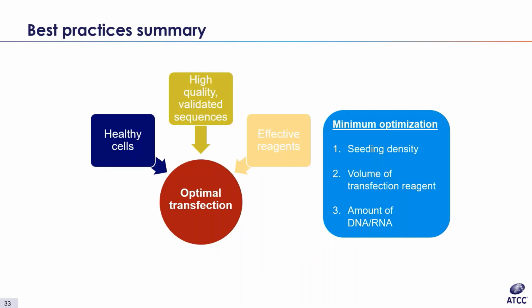And so this is the very last slide on transfection, and it's going to summarize best practices for the transfection section of this talk. To achieve optimal transfection efficiency, use healthy cells in exponential growth, free of contamination, DNA that is of high purity and endotoxin free, and the recommended lipid for each cell type and substrate should be determined. Every setup may require some optimization, including but not limited to seeding density of cells and the ratio of lipid to substrate.